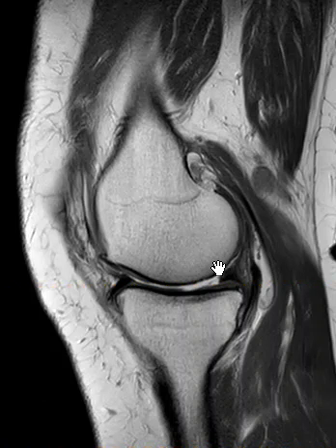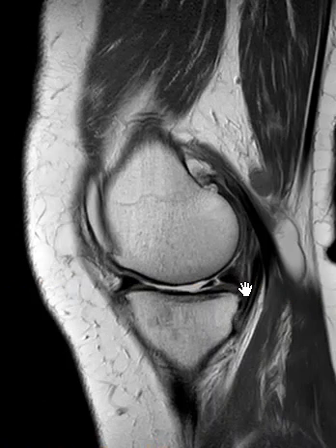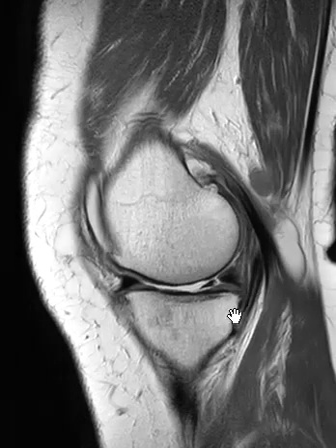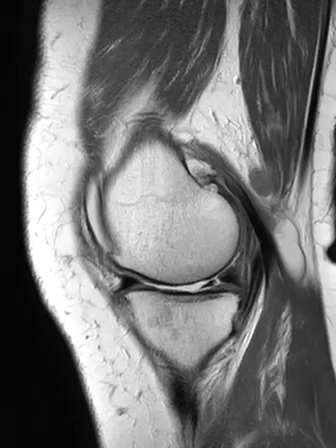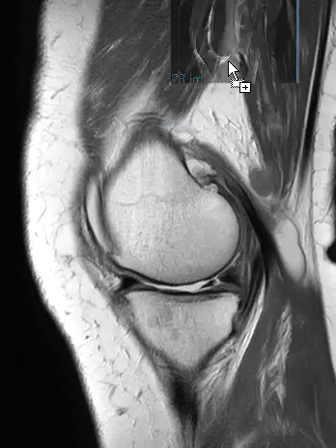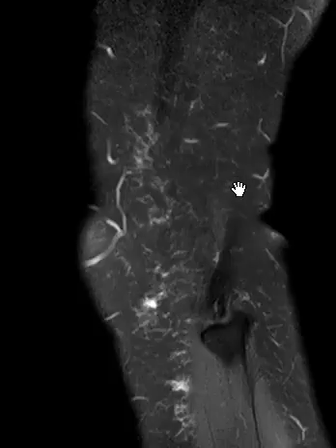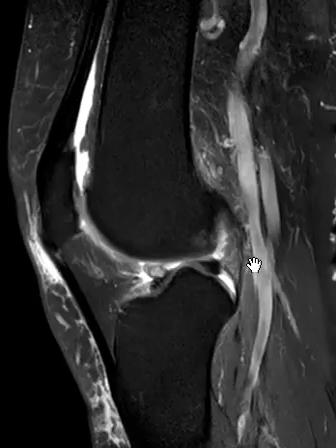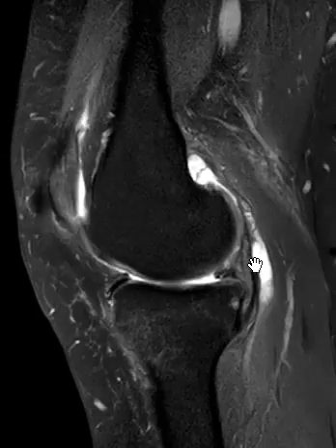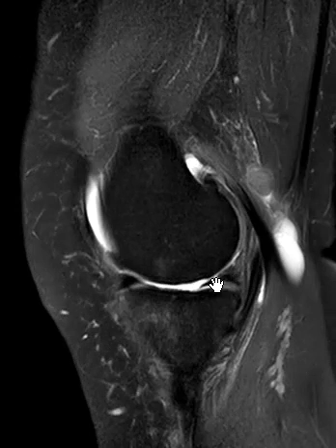We see here she has a tear of her medial meniscus in the posterior horn. This is the posterior horn, here's the anterior horn, and we see this vertical band. If we put on the sagittal T2 fat suppressed sequence, the lateral meniscus is looking great, but the medial meniscus has that fluid filled gap right here.